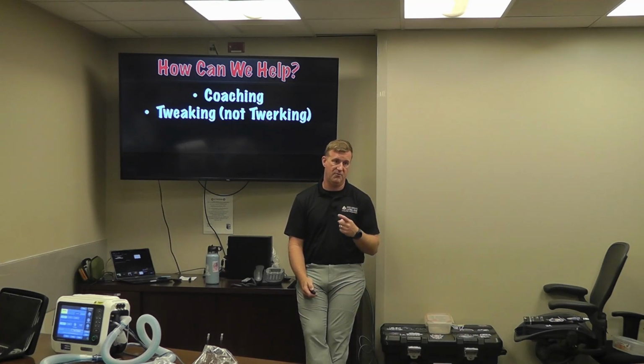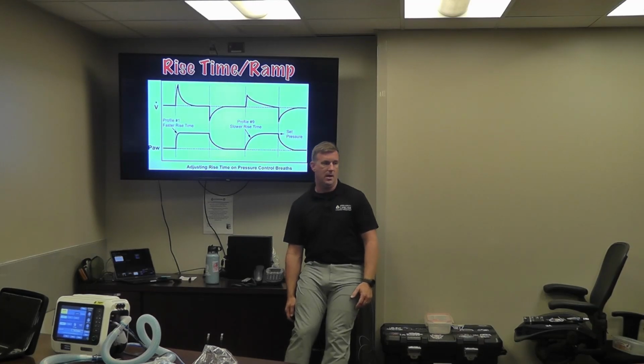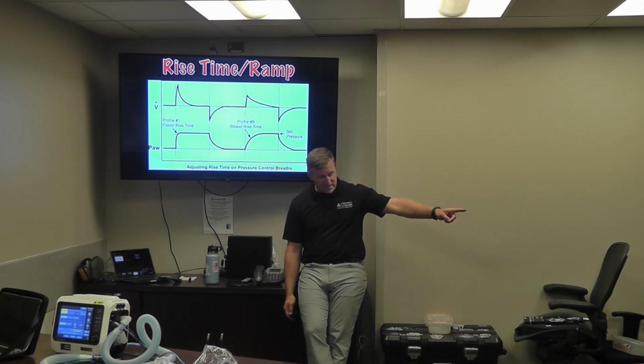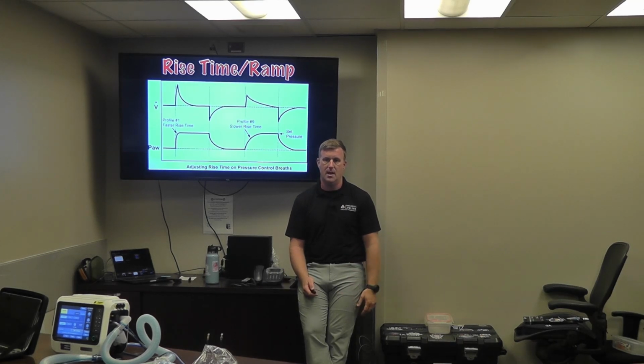Not twerking, not helpful. I tried it one time, did not help at all. But we can do some tweaking on the ventilator. And the big tweaking thing that you can do on the ventilator is what's called rise time or ramp. It's called rise time on the LTV. It's called ramp on the T1 and a bunch of different ventilators.